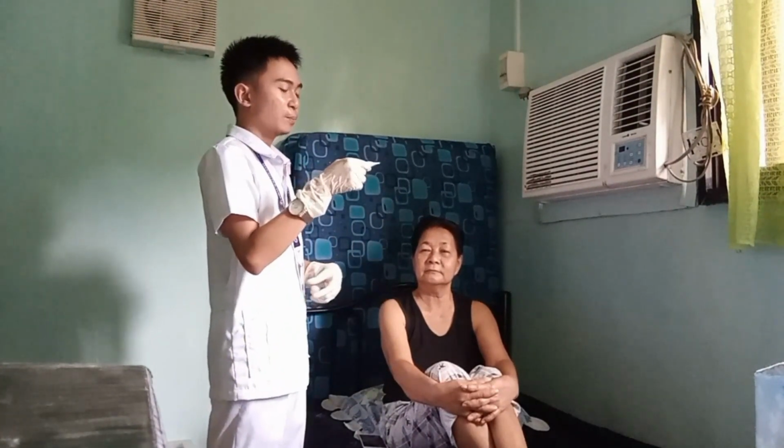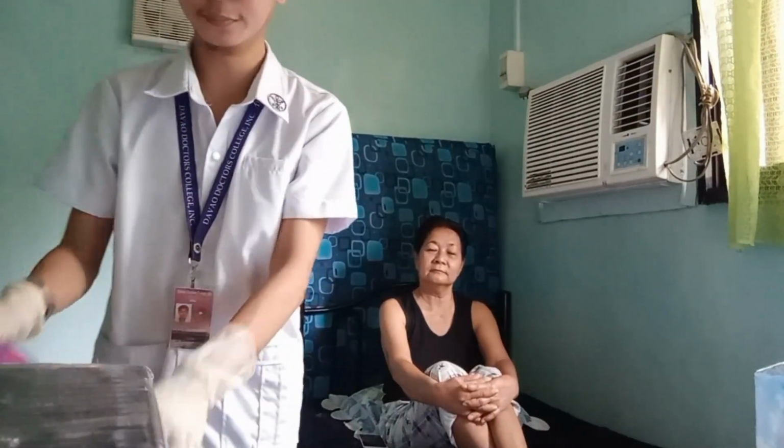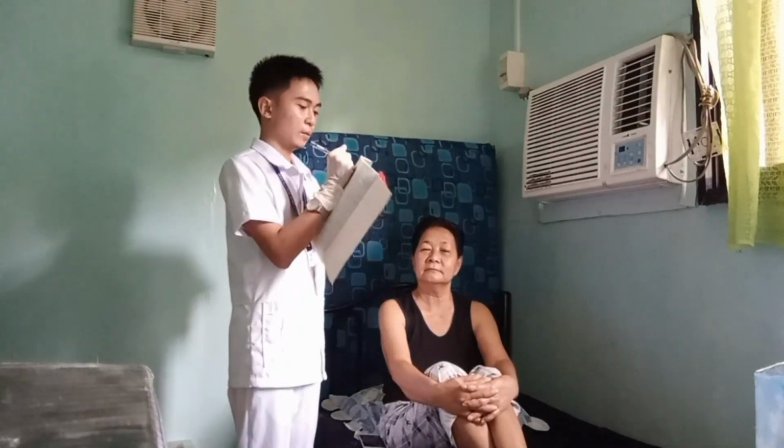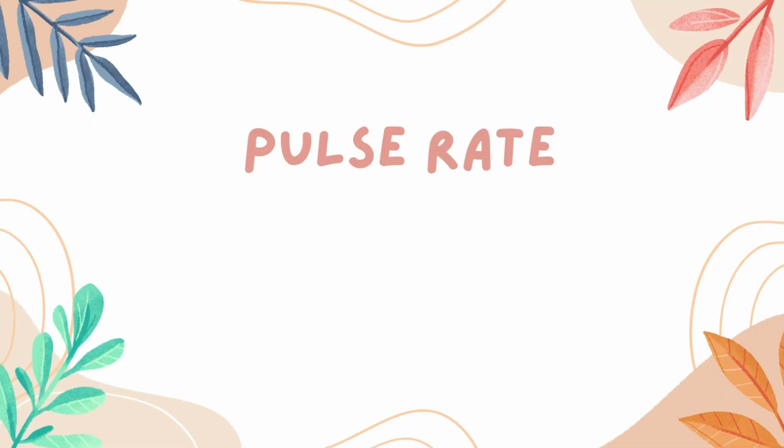So remove the thermometer and wipe it in a twisting motion from stem to probe. Your temperature is 35.6 degrees Celsius. And do not forget to document the temperature of the patient. Okay, thank you, ma'am.